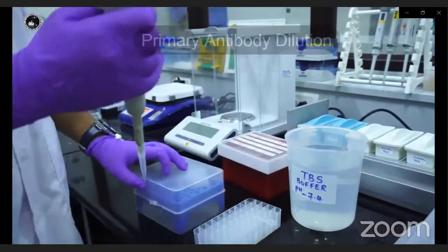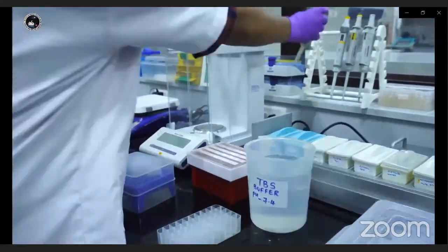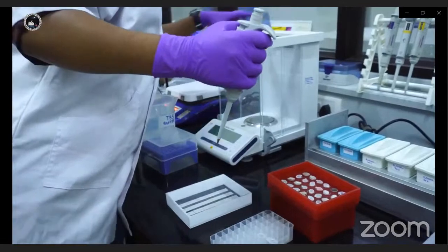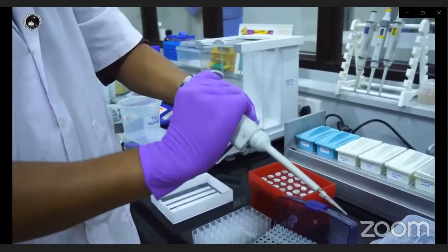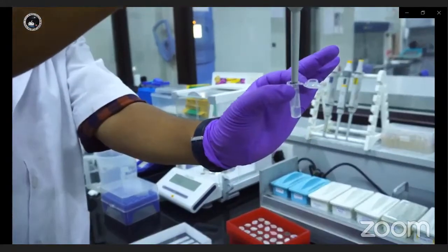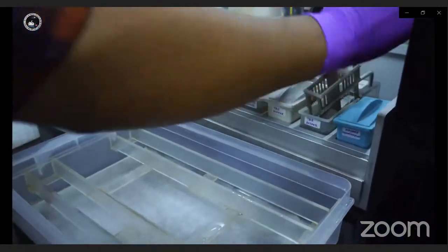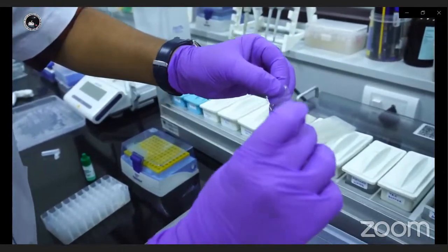The next step is preparation of primary antibody. Today, we are using GFAP antibody at 1:600 dilution. For this, I'm taking 600 microliter of TBS. To this, I will add 1 microliter of GFAP for 1:600 dilution and mix well. Once the antibodies are ready, wipe the slides around the sections in order to remove excess buffer.